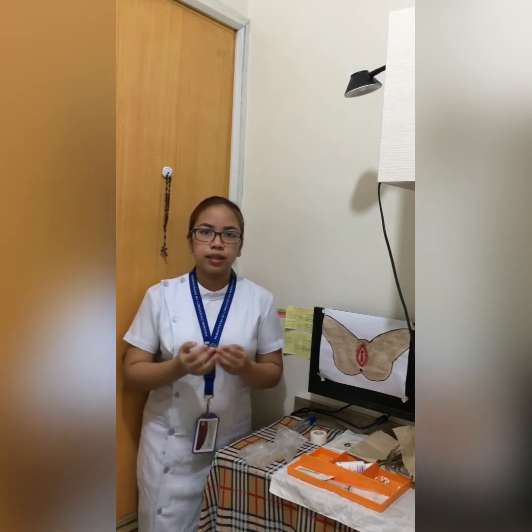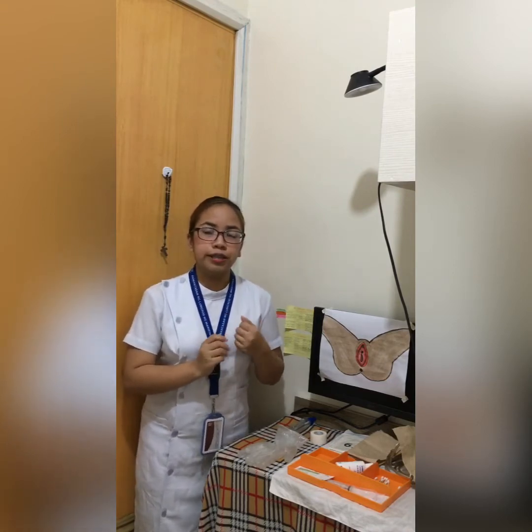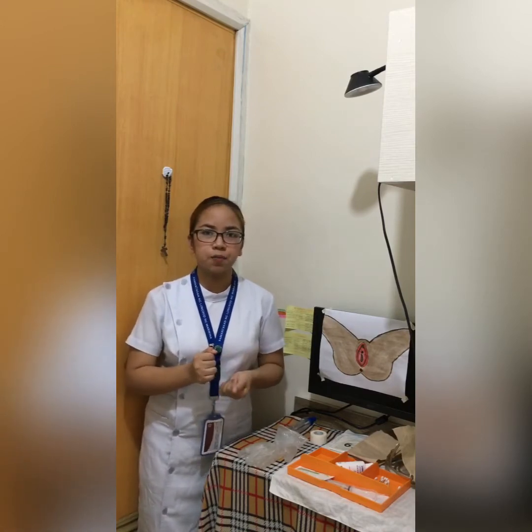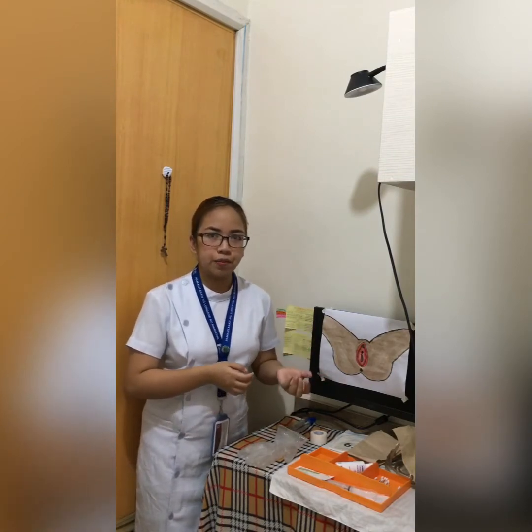So this is used to relieve discomfort due to bladder distension. It can also be used for emptying the bladder prior to surgery, and sometimes it is used to obtain a urinary specimen. So we can also have in the catheter kit a specimen cup.